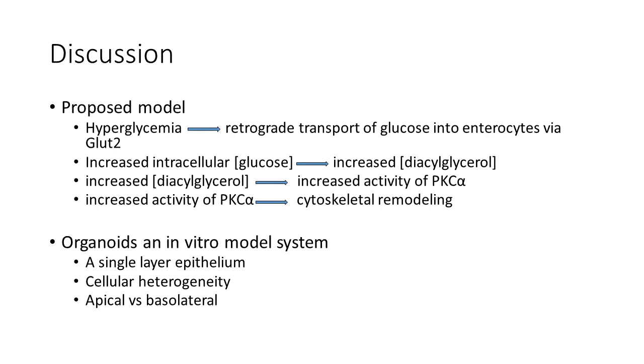The negative is that I think that our culture system is definitely still not well optimized. So I'll share with you that we have tried to generate organoids from different species. They work differently. Our cows are easy to work with. They're great. Cats are not as easy, right? Some of our attempts to generate organoids really weren't successful, and with that cell line, we just got lucky. I think it's like 1 out of 4 attempts.